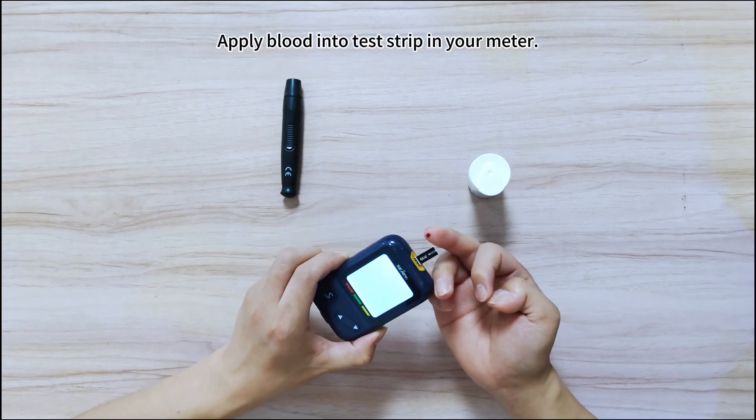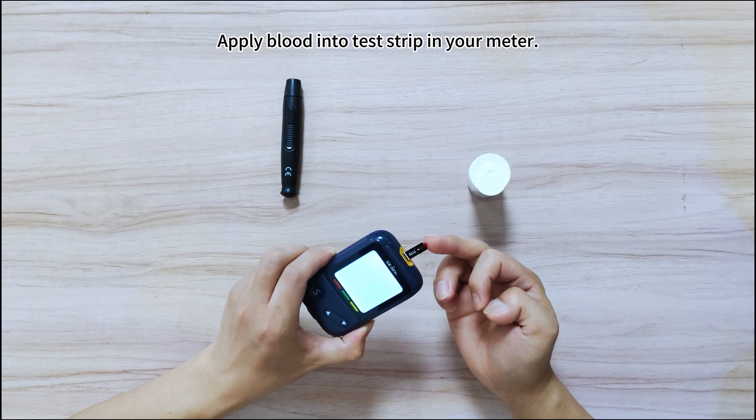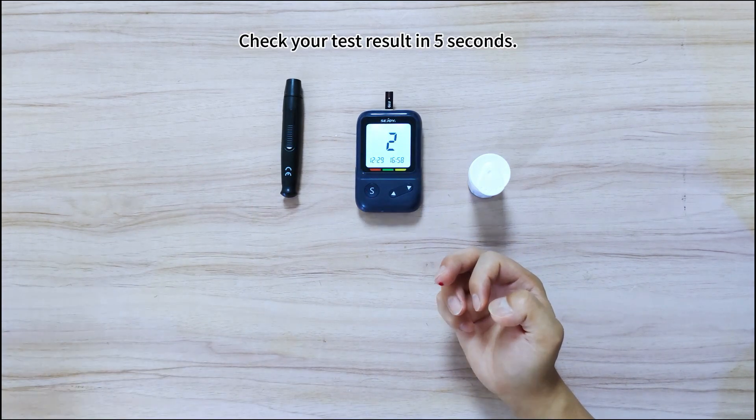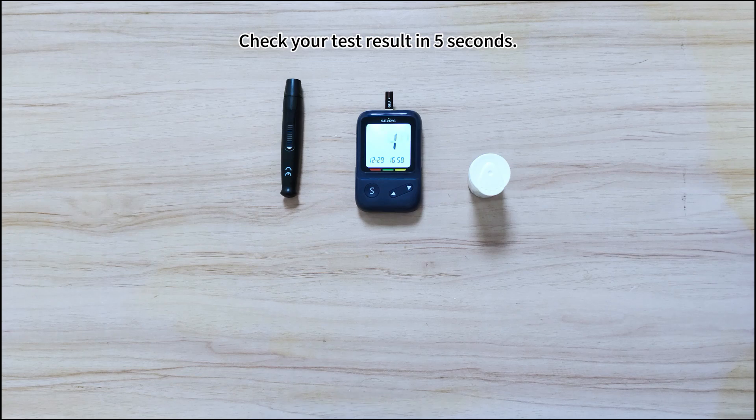Apply the blood drop into the channel of the test strip until the channel is fully filled. Wait for 5 seconds and check your blood glucose test result along with the date and time of the test.